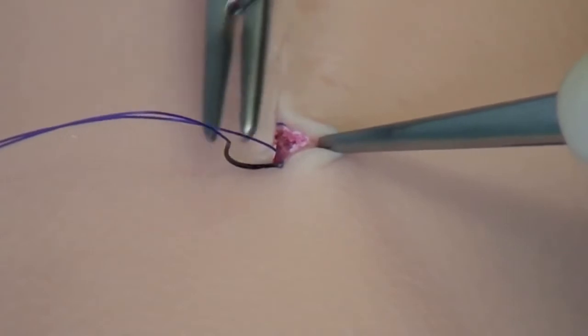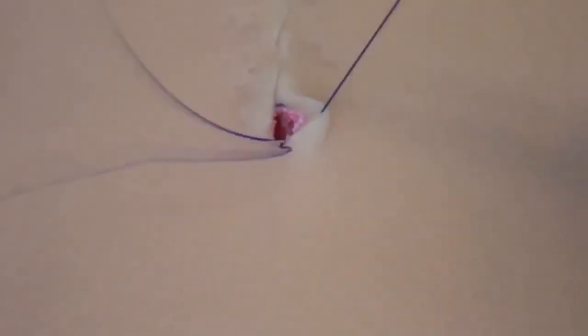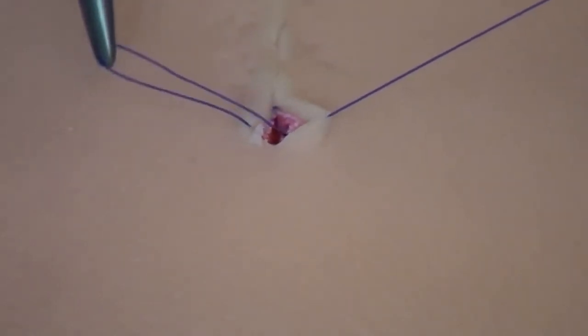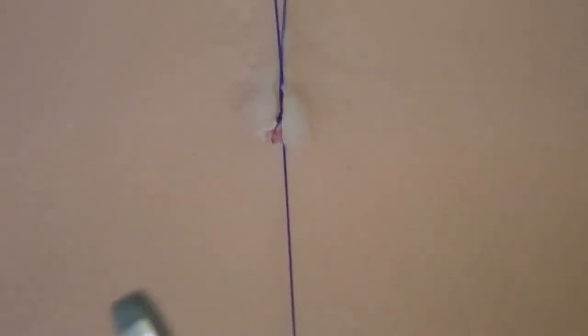In the end, a V-shaped stitch is performed. The thread is not pulled through completely. A loop is left to close the suture with a surgical knot. When tightening the knot, make sure that the thread is pulled in the direction of the incision.